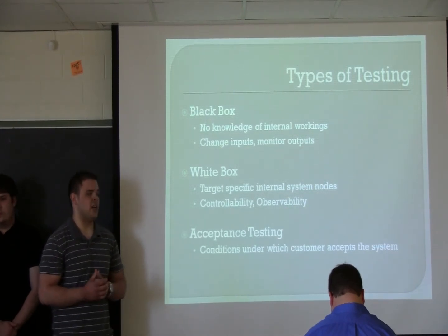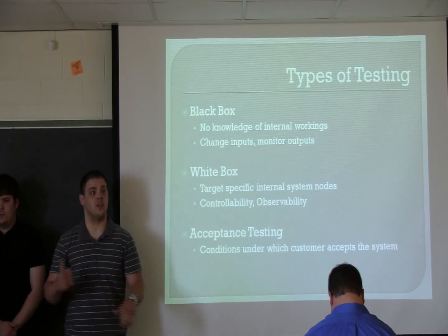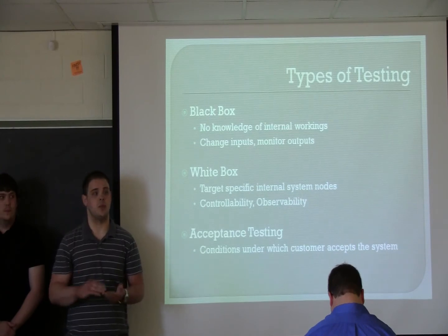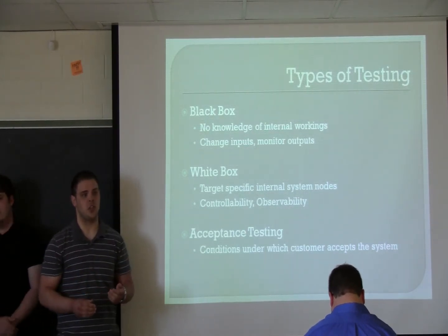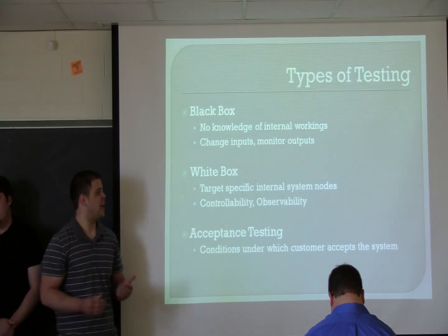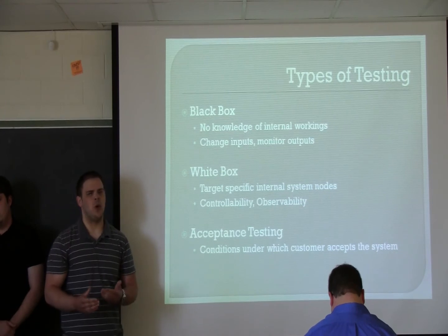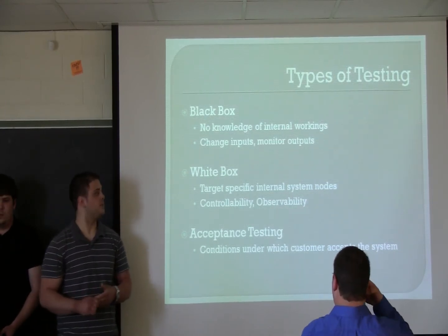White box testing is when you actually target the internal nodes of the system. So we have several sensors. We have the pulse sensor, the temperature sensor, and the respiration sensors. You can target these actual specific nodes using white box testing and make sure that they are operating as they should. And the way you do this is you can control two things called controllability and observability.